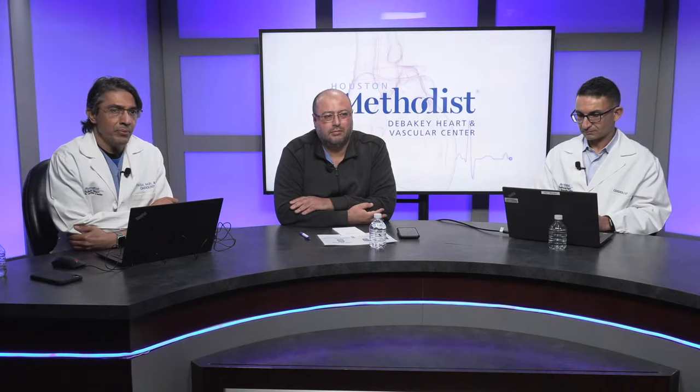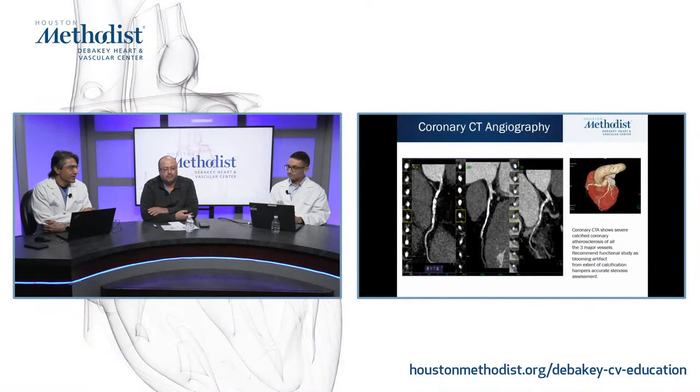And this is a good example. This was a patient who had, as you discussed, a very high pretest probability with known vascular disease. You can more than likely expect involvement of the coronary circulation. You don't know the extent of coronary calcification, but you can see here this patient had a CT with tremendous amounts of calcium and blooming artifact, which can really impair your ability to see the lumen of the artery and therefore determine stenosis severity.